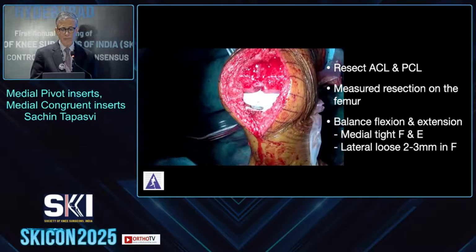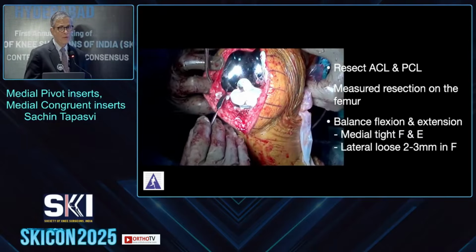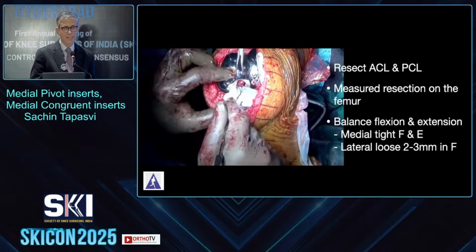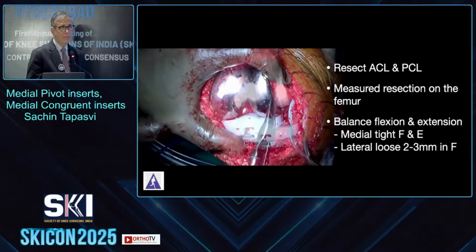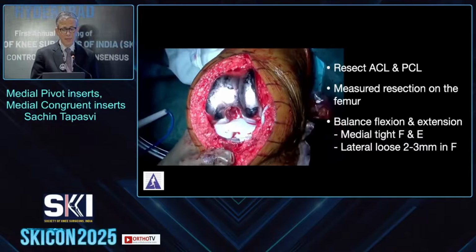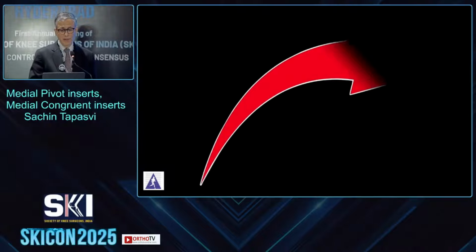The important aspect with this particular design is that you have very good sagittal stability, and even if you take off the PCL, there is absolutely no risk of any form of residual PCL laxity. You can retain the PCL if you wish to when you're using this insert, but it is not required, and this is the rotation that you should be able to achieve when you have prepared this implant.